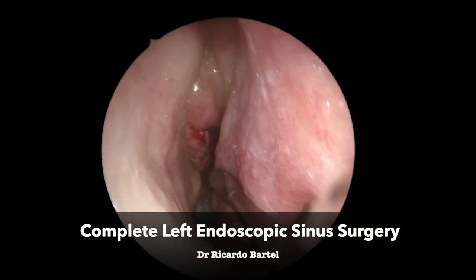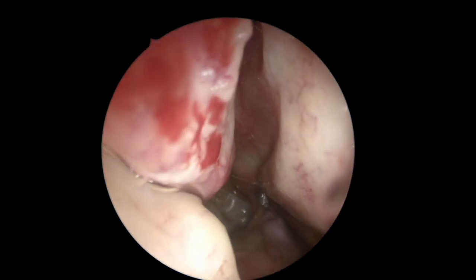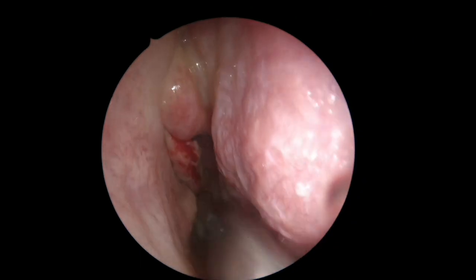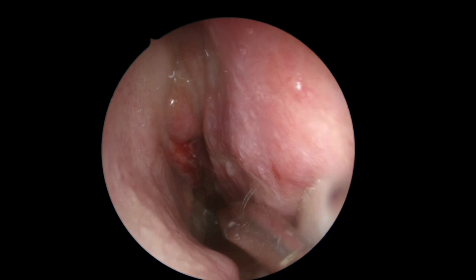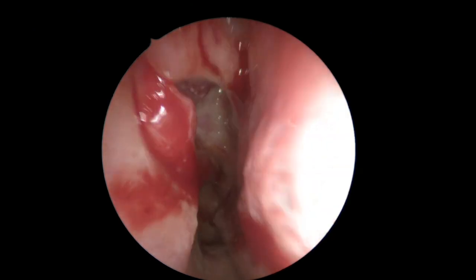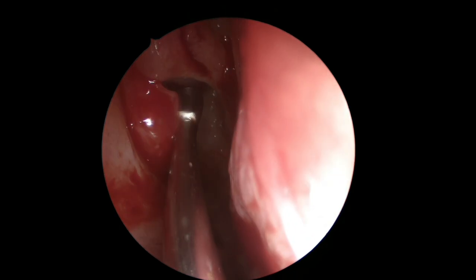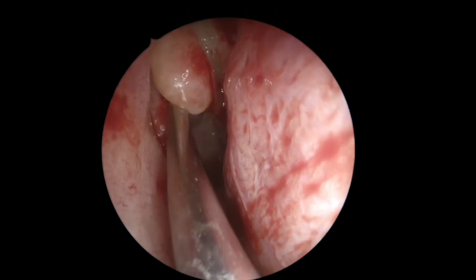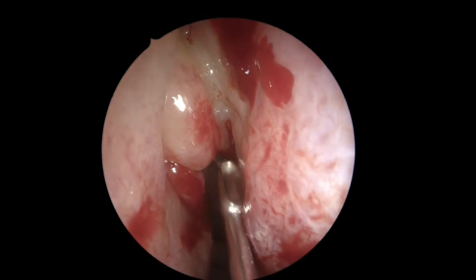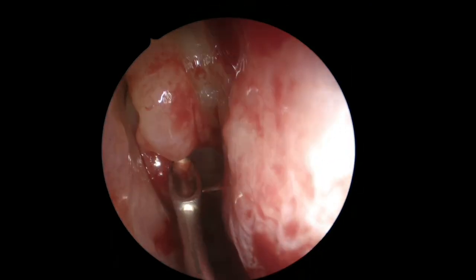Good day. Today we're going to show another case of complete endoscopic sinus surgery — in this case, the left side. The patient has diffuse chronic rhinosinusitis, bilateral septal defect, and a few polyps. We treated him with oral corticosteroids prior to surgery; a week before, he started systemic corticosteroids just to get the disease into a better state before surgery.